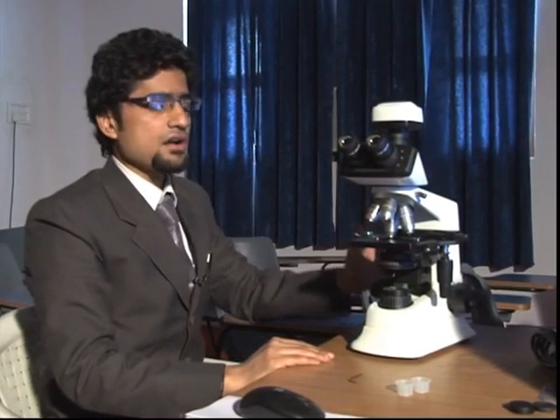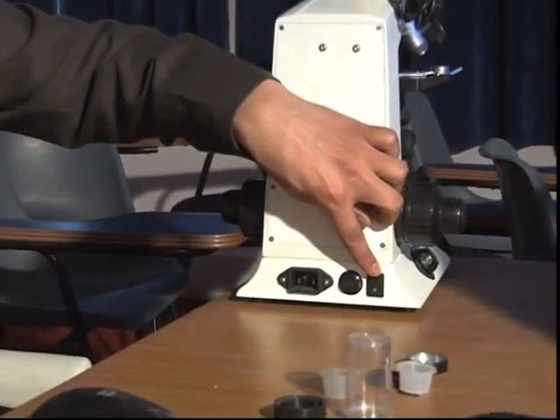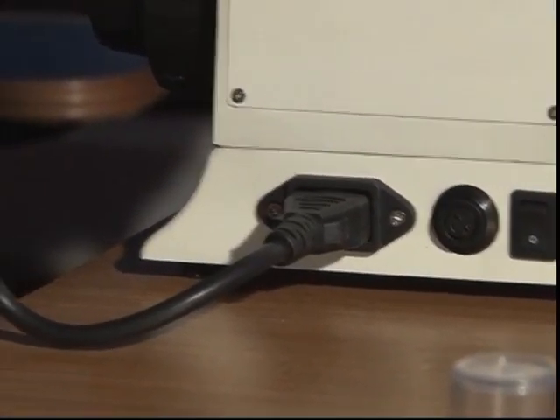This is the complete hardware installation of the trinocular microscope. Now we move on to the software installation. Understanding the ports of the microscope: this is the power port, this is the fuse, and this is the main on/off switch. The power cable is inserted in this fashion and this point is inserted in the power plug.